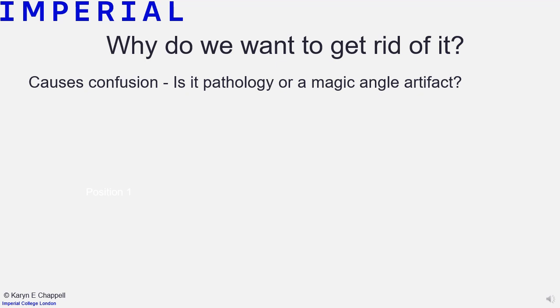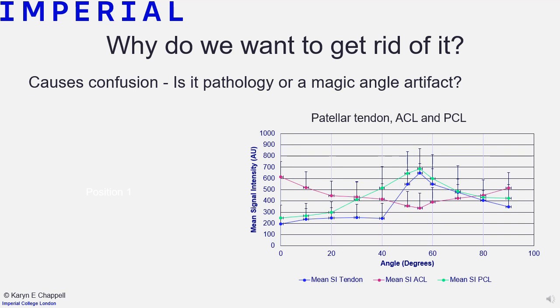Developing magic angle imaging for a whole joint is very complex. The literature describes mainly single excised tissues. The problem is that multiple tissues have different anatomical positions, multiple fiber orientations that must be orientated to have a magic angle effect. When positioning a limb, there is absolutely no way of knowing the alignment of the collagen-rich structures, as they are hidden from view and cannot be palpated.